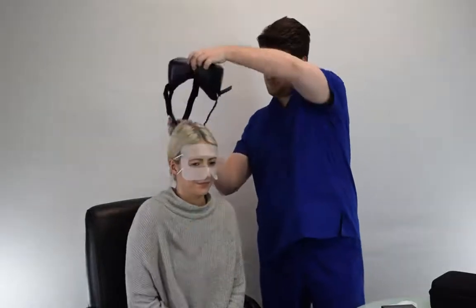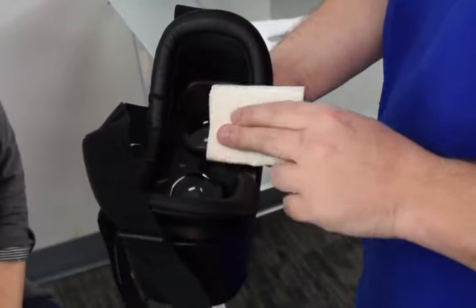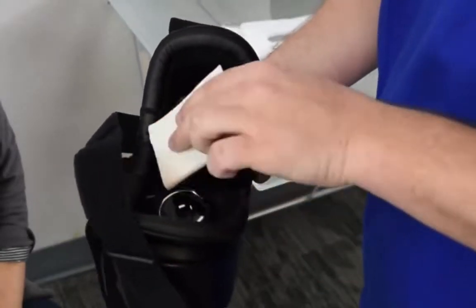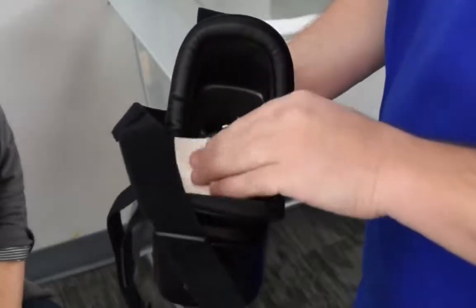Once testing is complete, help your patient take off the headset and dispose of their face shield. Cleaning the VF2000 is easy — all you need to do is wipe the device down with a disposable alcohol wipe and it's ready to use on the next patient.